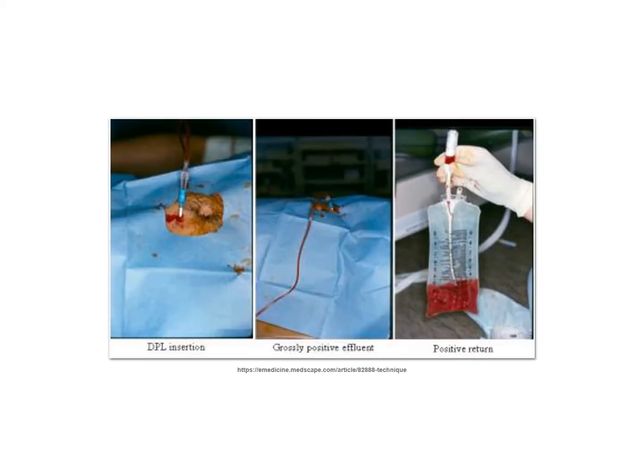So I talked a little bit about how the FAST exam was historically significant, and we're going to talk very briefly now about its origins, and that's mostly so that you have a very clear understanding in your mind about how it fits into your practice.